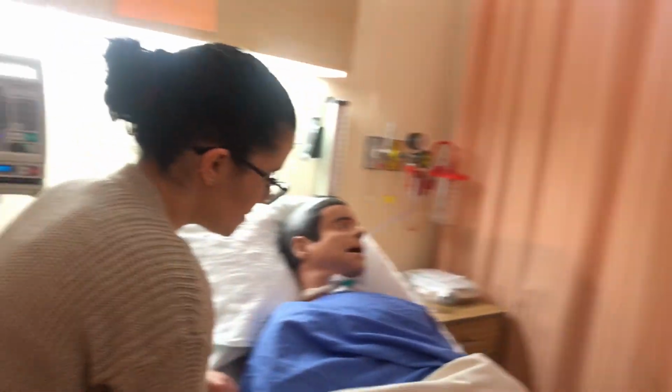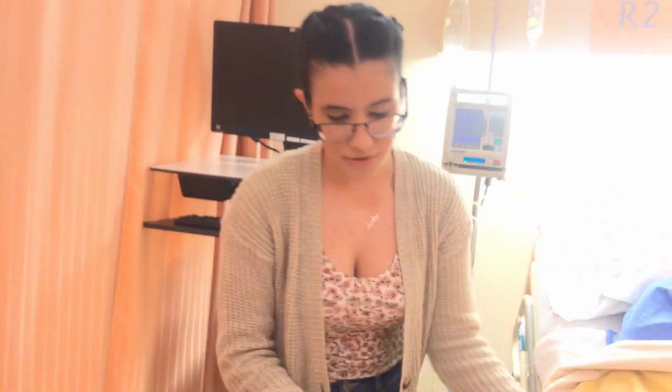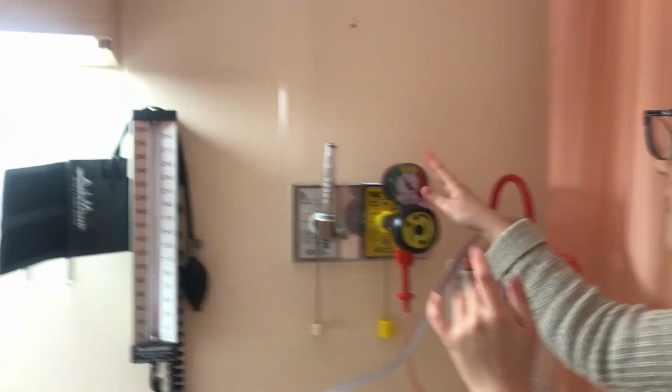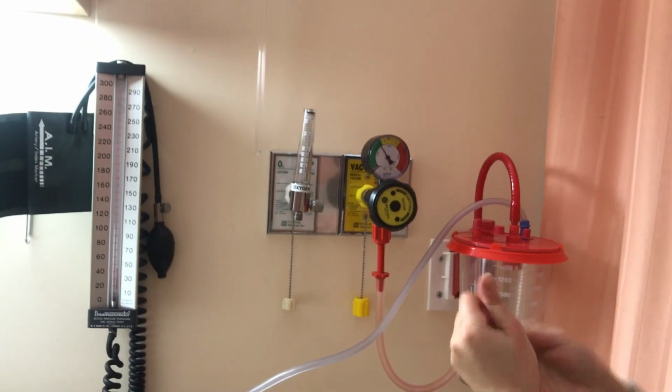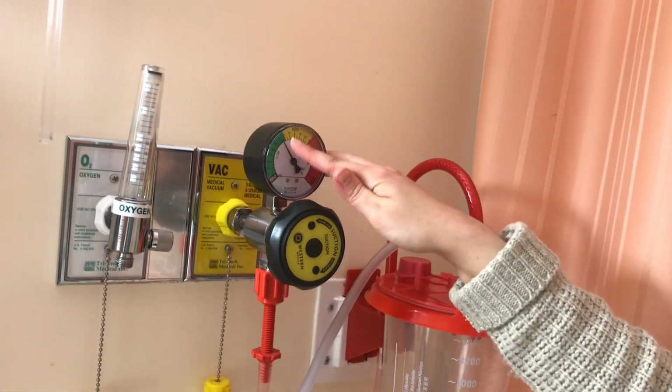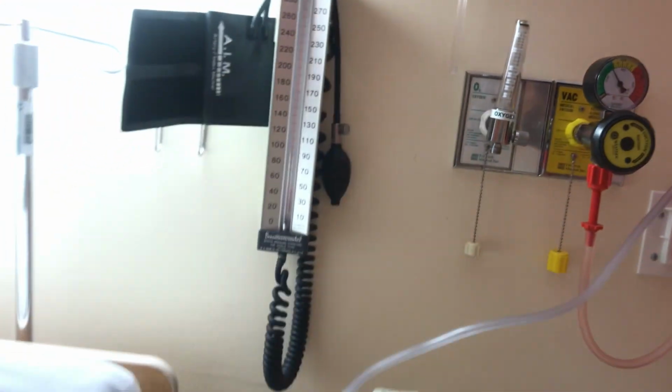So now I can demonstrate what we will do for chest tube care. So the safety check that we're going to do for chest tubes is going to come along this way. So they need to be on continuous low suction. So I see that this is intact, it's on, it is within the low, and then I'm just going to trace the tubing.